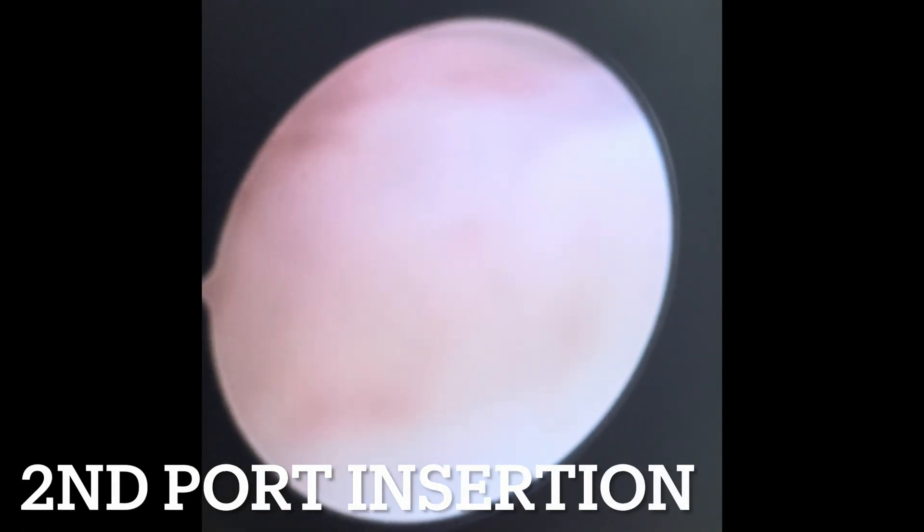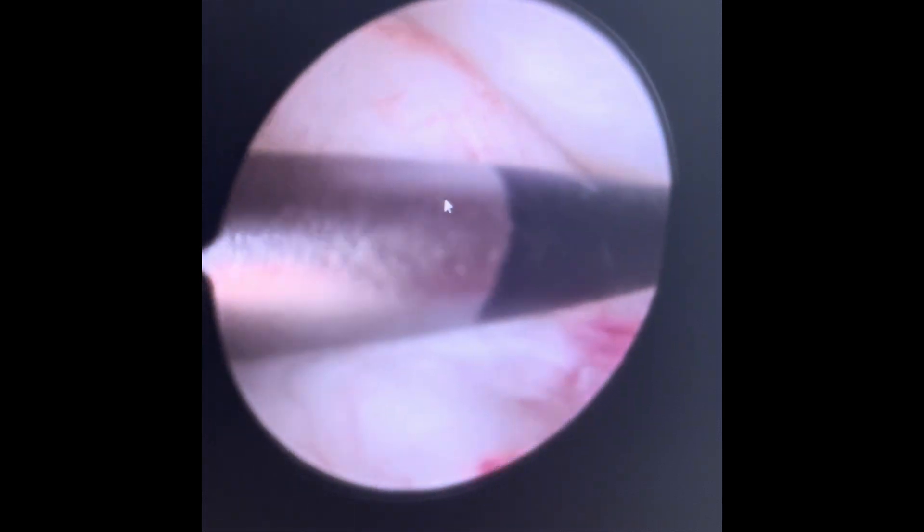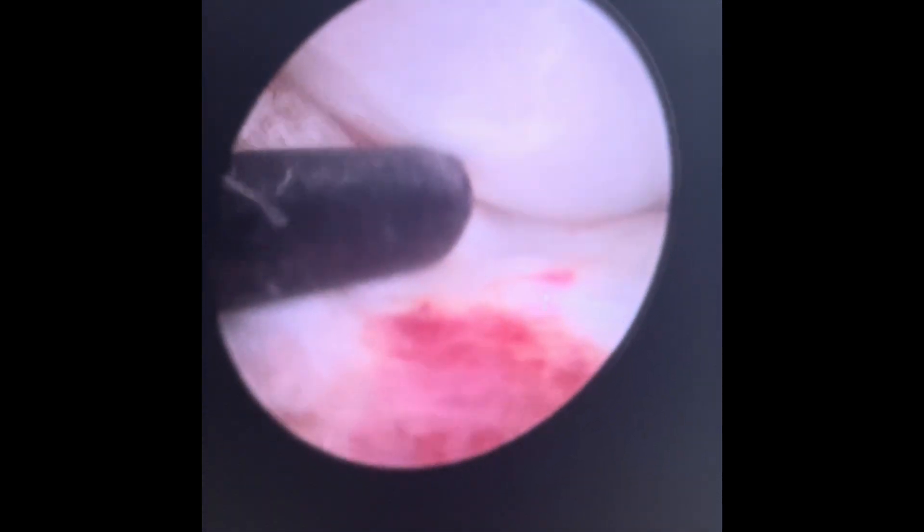At around two minutes fifty seconds you can see the edge of the second port, which is just in front of the scope port. I put a straight instrument through that port under direct vision into the retro discal region, pick up the fibrous band at the back, and use that by pressing downward and backwards to reduce the disc. You can see the disc nicely unrolling as it's being pulled back and outwards, and it's held in that position by my assistant.